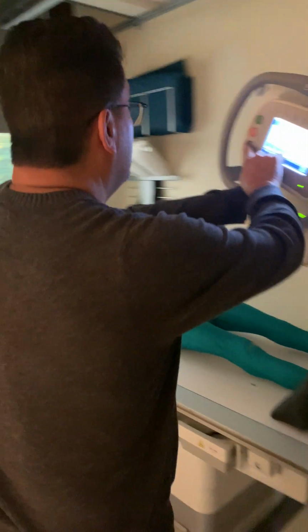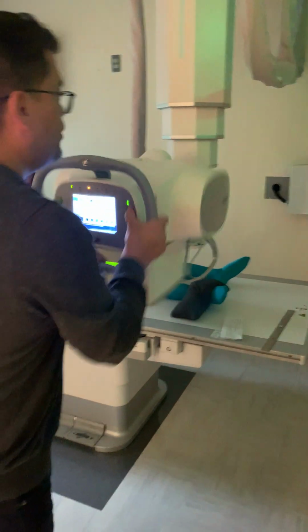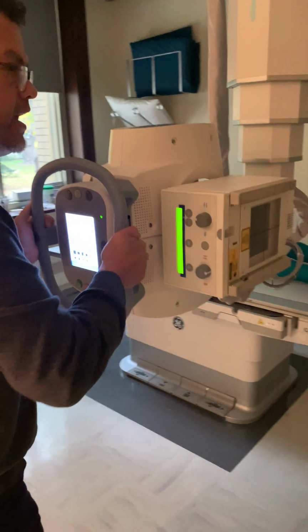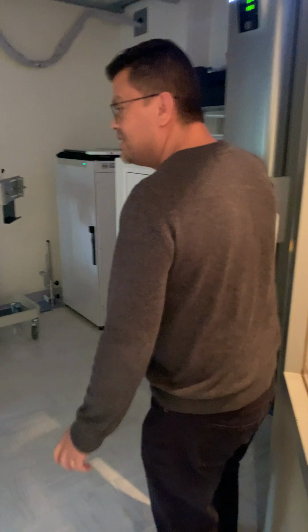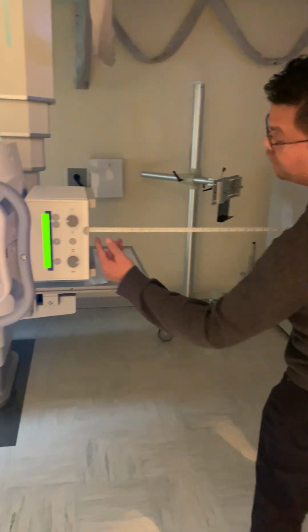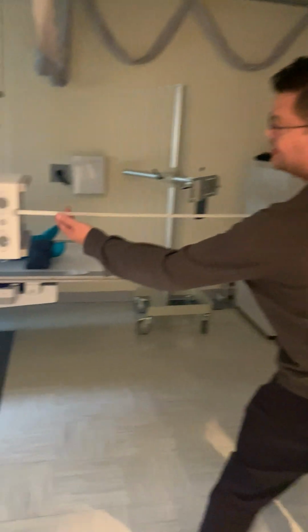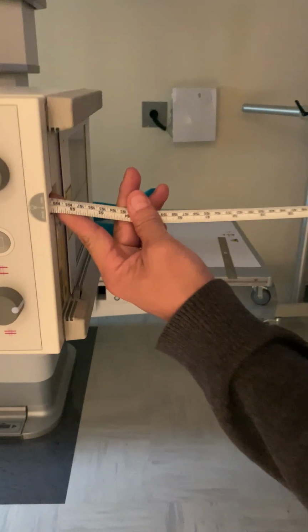Next thing to do is to bring my X-ray tube over and set it in such a way that will allow me to measure the SID. The SID is like what is written on the paper, 180 centimeters. And right now I'm at 154. So what I want to do is I want to bring it back, calculating more or less what I need, and then measuring again. And now I'm at 169, 170.